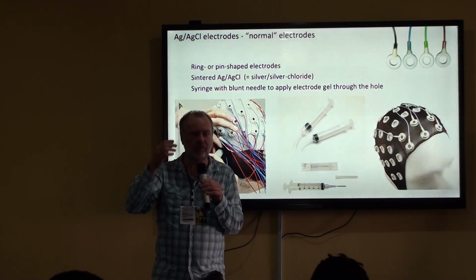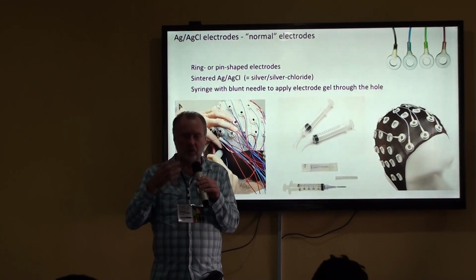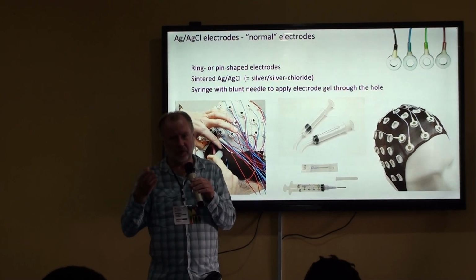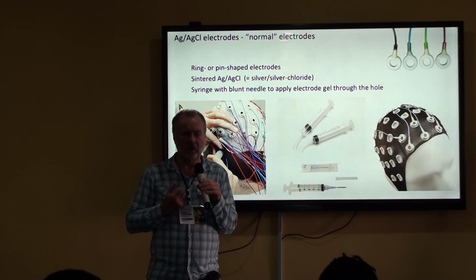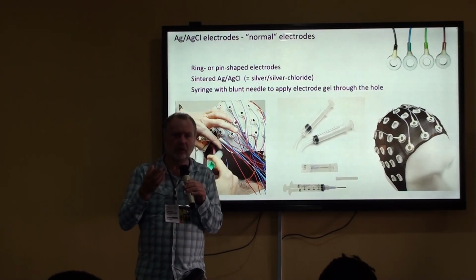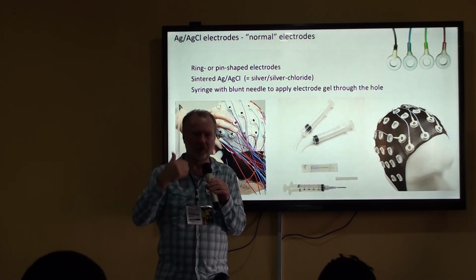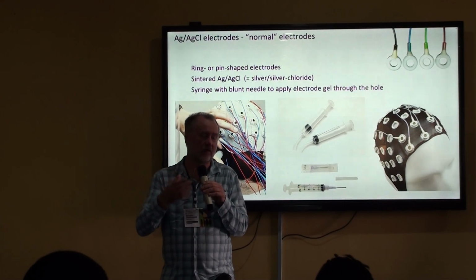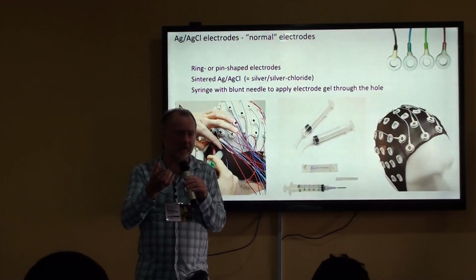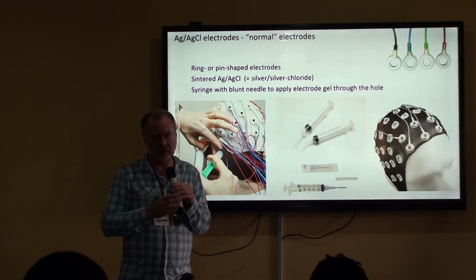And I think for those types of applications, you would indeed have other requirements than we have in a more controlled lab environment. Wireless might not be the most important, but being able to transmit the data over a long distance would be important. I know that EEG companies have worked on that. It's a field of clinical research that I'm not working in, so I don't know what is done there.